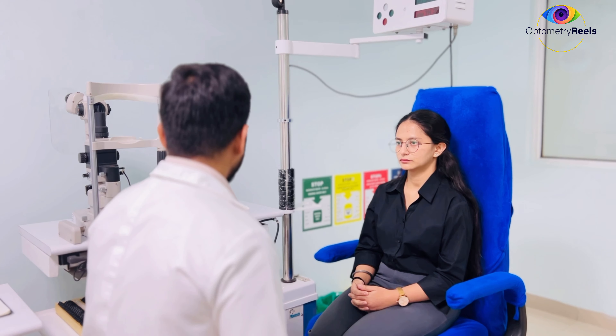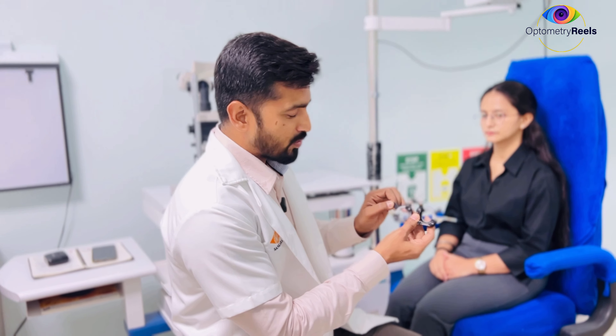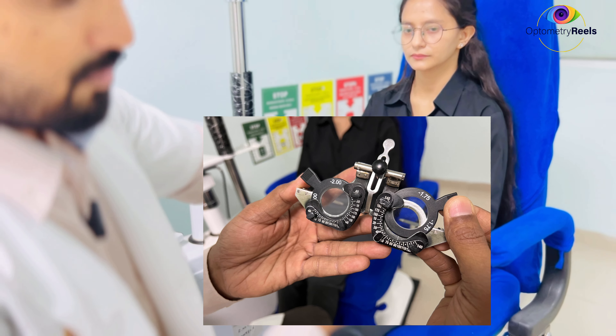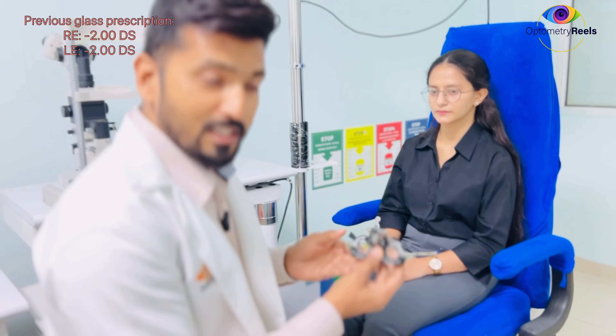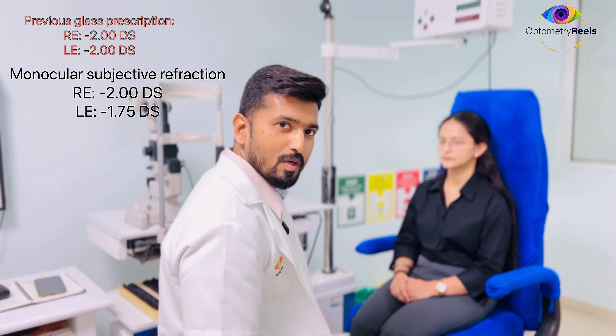On this side, temporarily I feel headache. So what we did — we did a refraction again and found my monocular subjective refraction in the right eye to be the same as what she is using: –2. Left eye, I found –1.75, but she is using –2. This is slightly less, but still I will be doing binocular balancing to confirm whether the accommodation in both eyes is balanced or not.